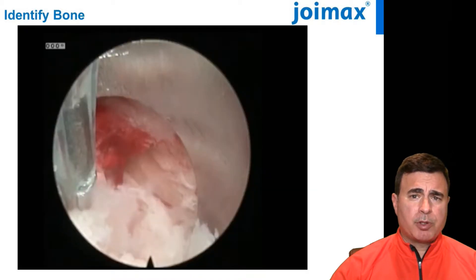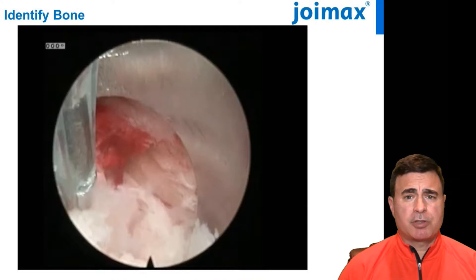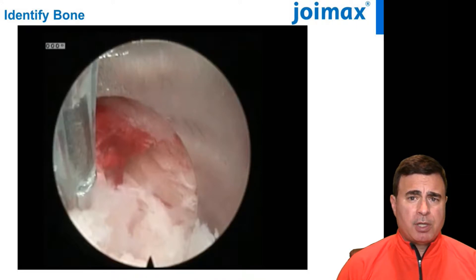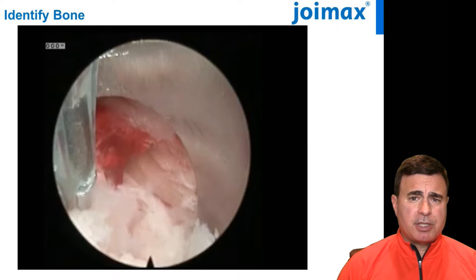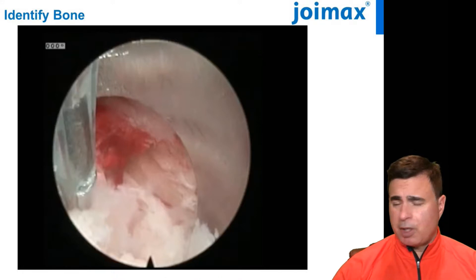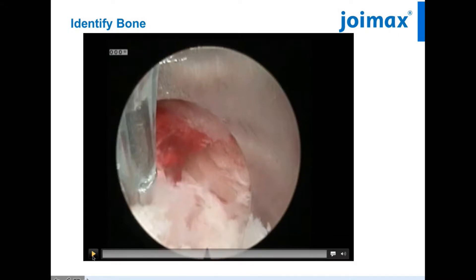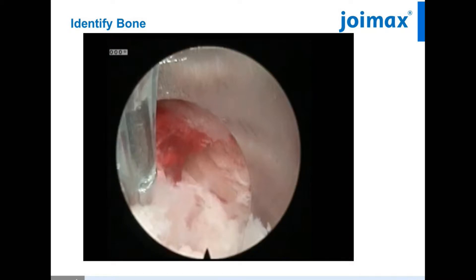I think one of the most important things in the anatomical structures to identify is the bone. Early on it's especially easy to become disoriented, and if you know where the bone is you'll always be able to maintain your orientation. As the orthopedic surgeons say, the bone is home. Here's a short clip identifying the bony anatomy.